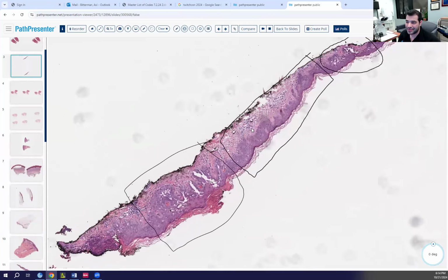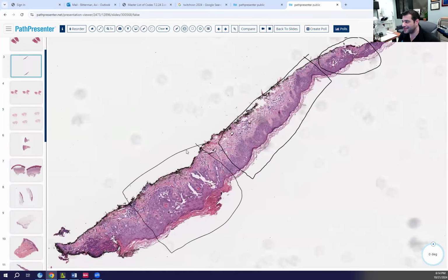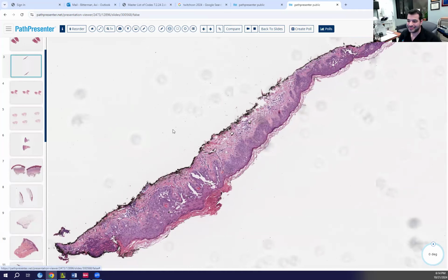But what acantholytic dyskeratotic process has these little foci of acantholytic dyskeratosis? It sounds more like Grover's. Yes, exactly. So the point is to not confuse acantholytic dyskeratotic processes with part of your bullous differential.